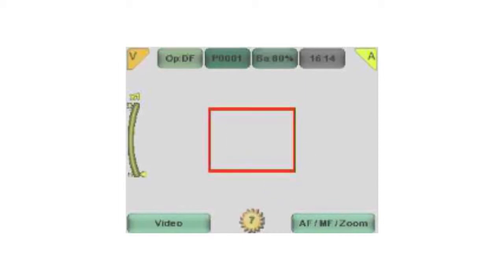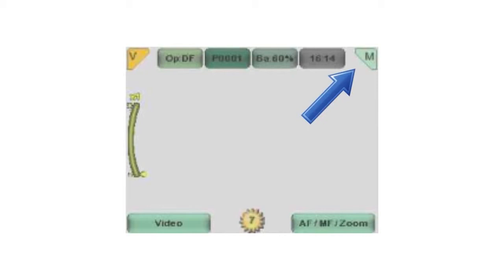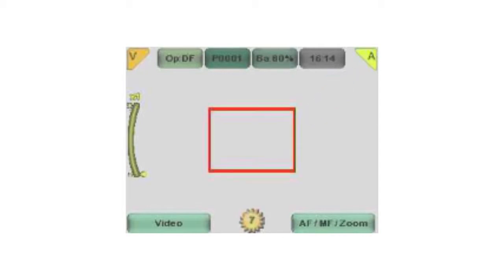The focus mode can be switched by short pressing the right soft key. The icon in the top right corner of the screen indicates the selection. M indicates manual focus, A autofocus, and Z zoom. There are 4 different zoom levels: 1x resolution, 2, 4, and 6x resolution. You can zoom in and out by pressing the up and down arrow keys. The icon on the left of the screen will indicate the zoom level.